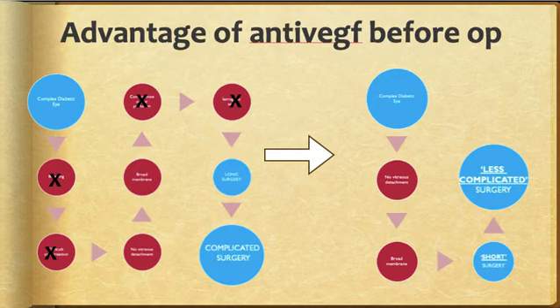So by simplifying the complex surgery, it is quite common before this that, when it comes to diabetic vitrectomy, we do like 2 hours of surgery. But now it becomes less and less complicated, and it's quite common to finish the surgery within 1 hour or less than that.